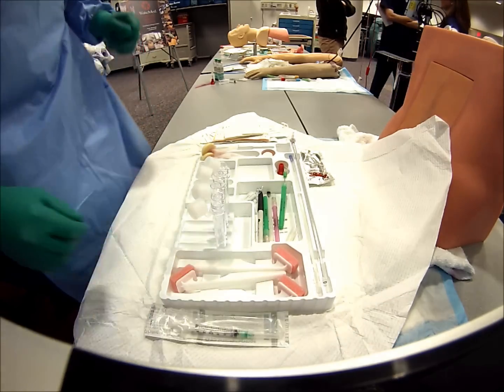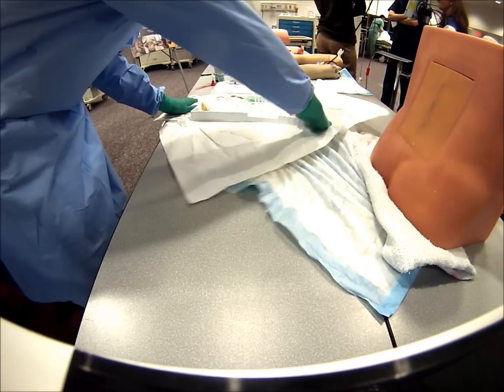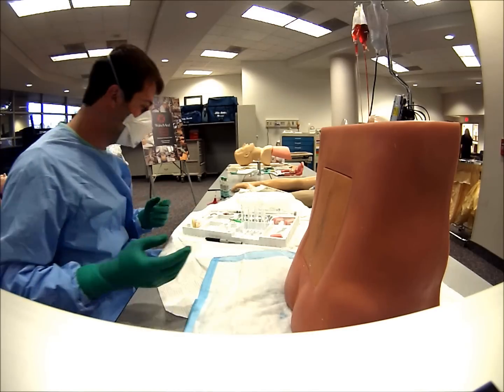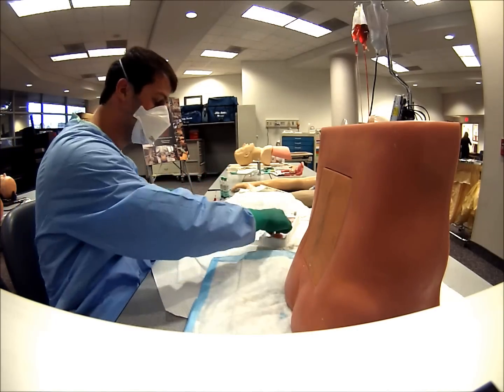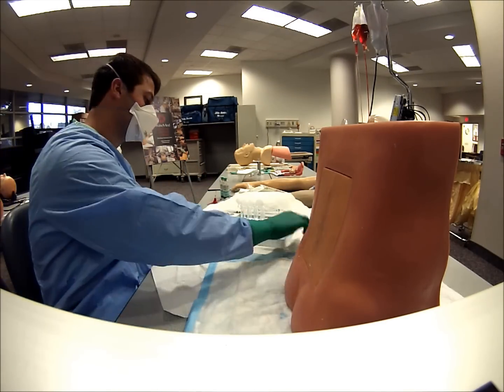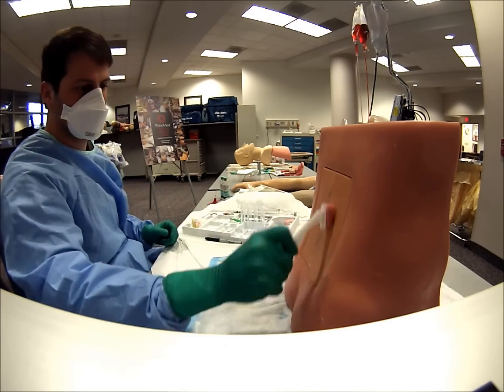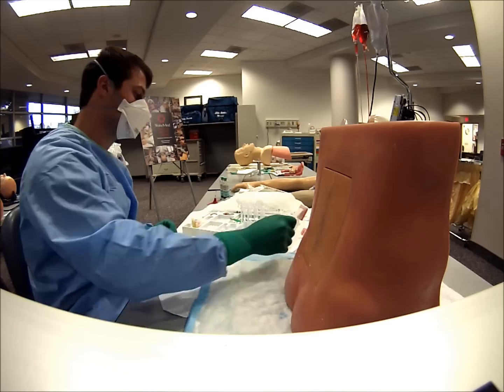Now that we are all set up, we are going to sterilize the area with a betadine or iodine solution we had previously set up in the lumbar tray. You're going to use all three of the sponges, soak it up, and work from the middle outwards in large concentric circles, providing a large area of sterilization.